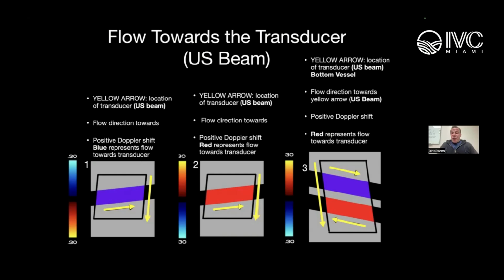No, actually, I thought you articulated that very well. Exactly. And some of the points that you just made will be further made as we get a little bit further in the orientation of the color. Okay, all right.